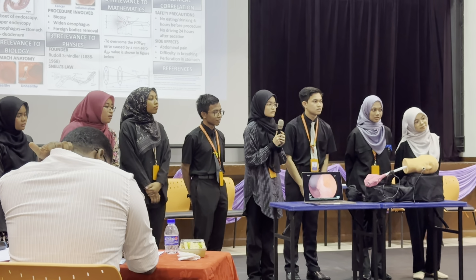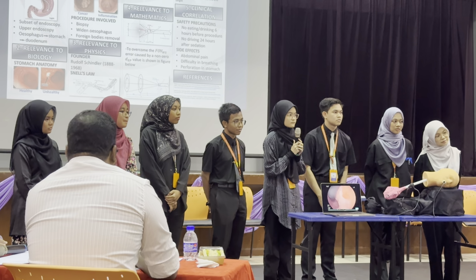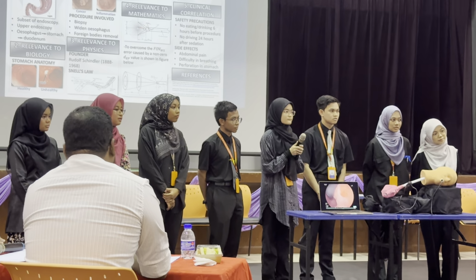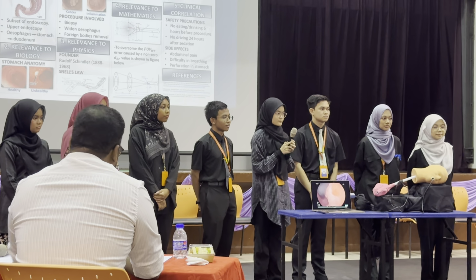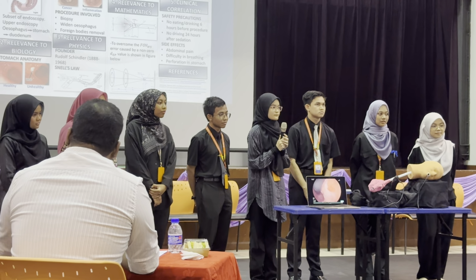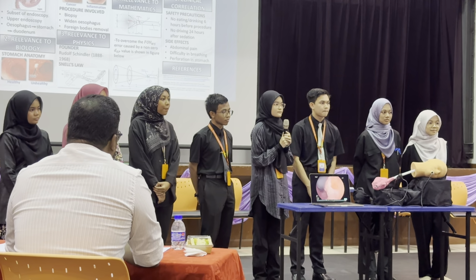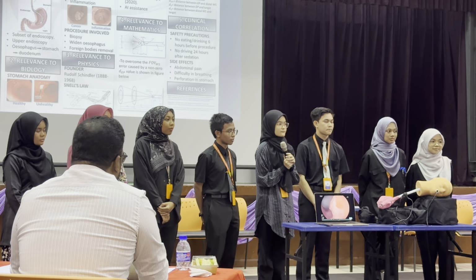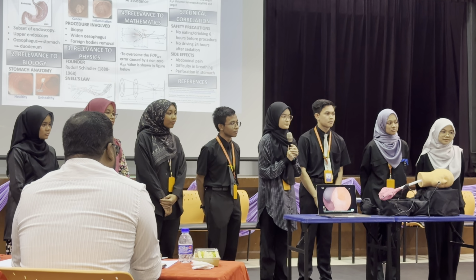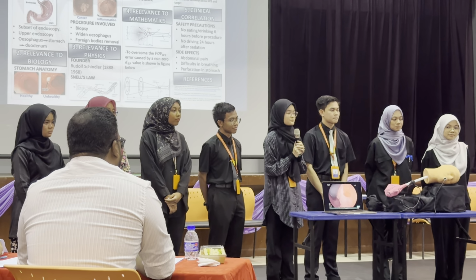Earlier we used to have stainless steel with mirrors. They would go like a telescope, like a car antenna or transmitter antenna. You keep putting them, and the inner part keeps going inside and inside. Those were called rigid gastroscopes. Because they were rigid, they were very discomforting for the patient.